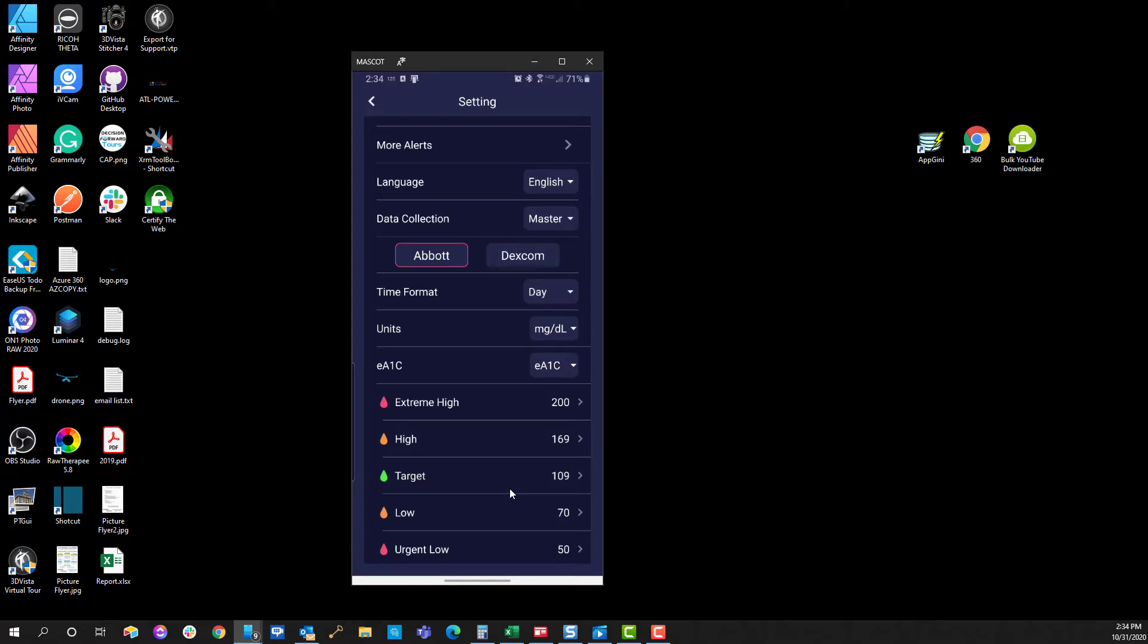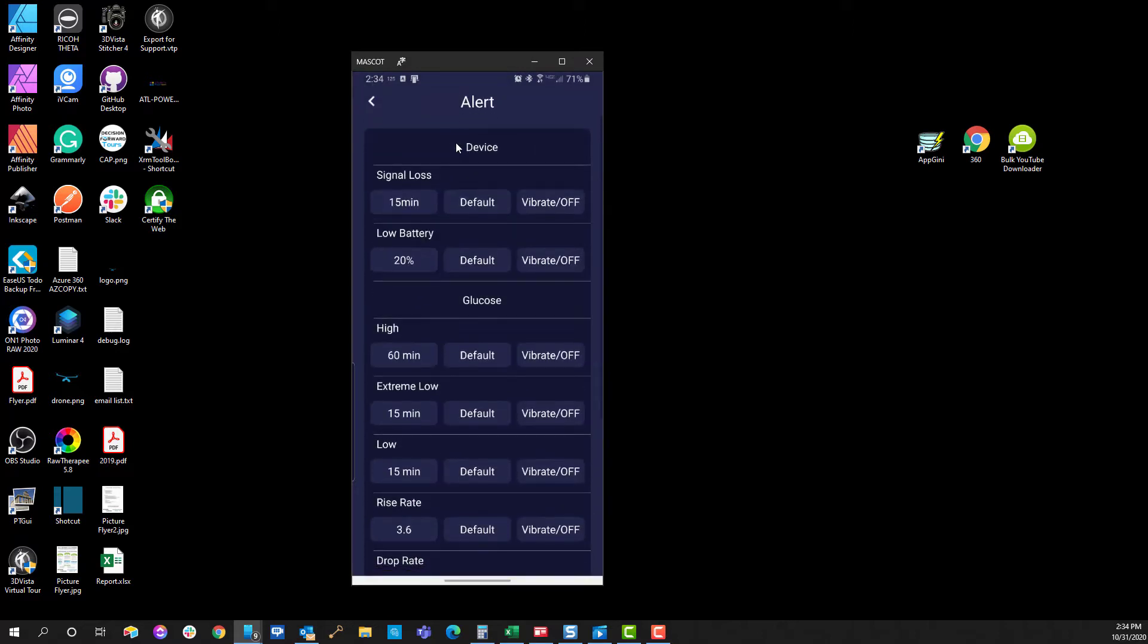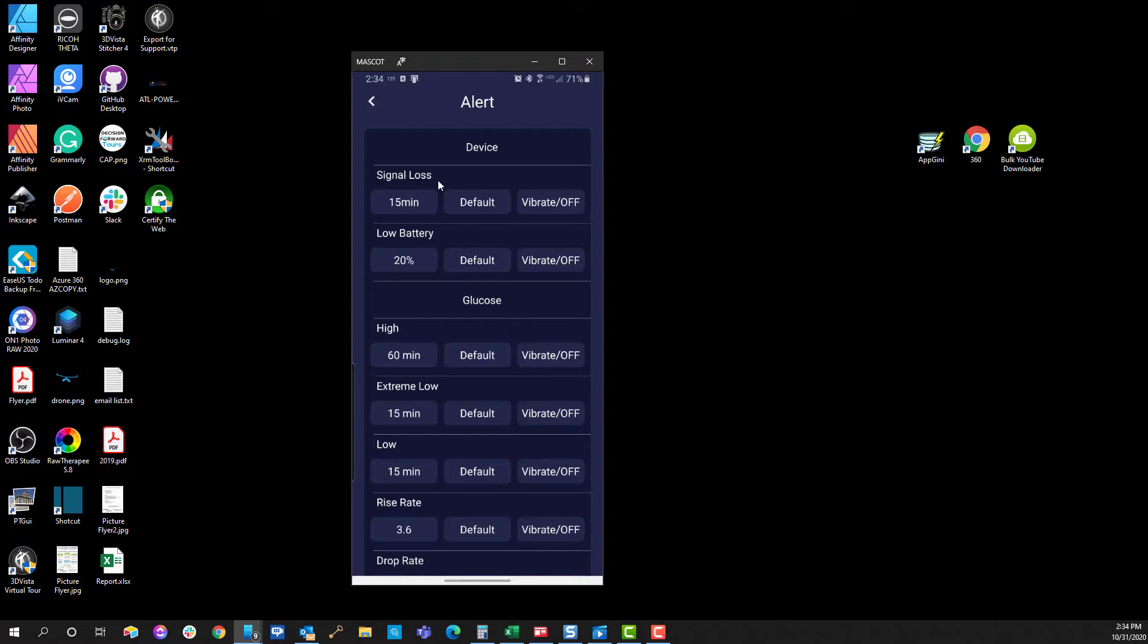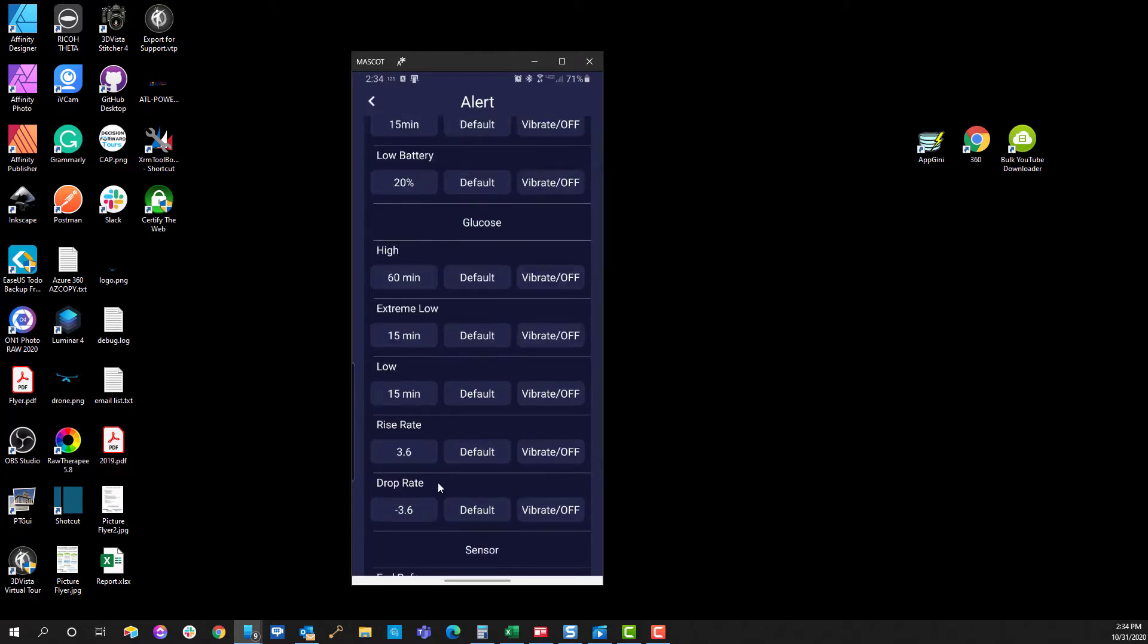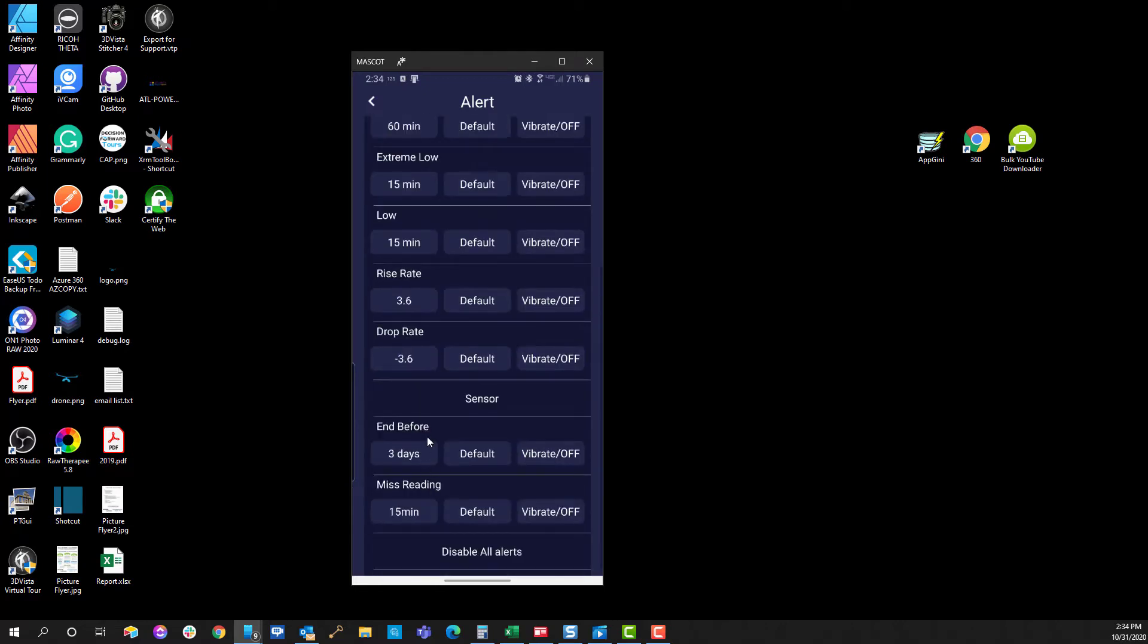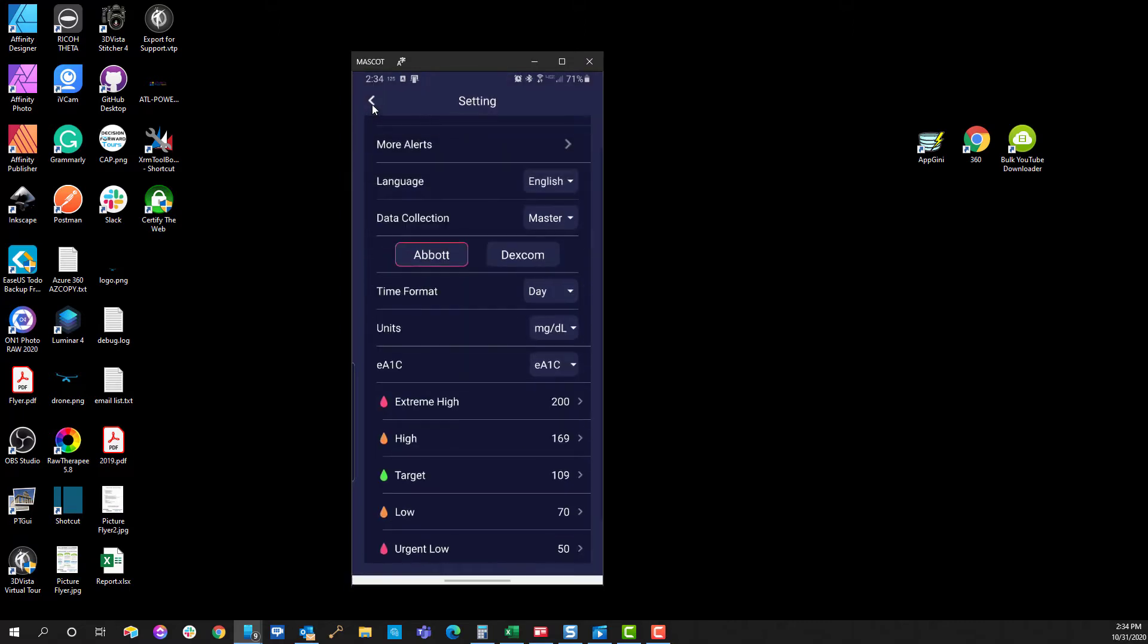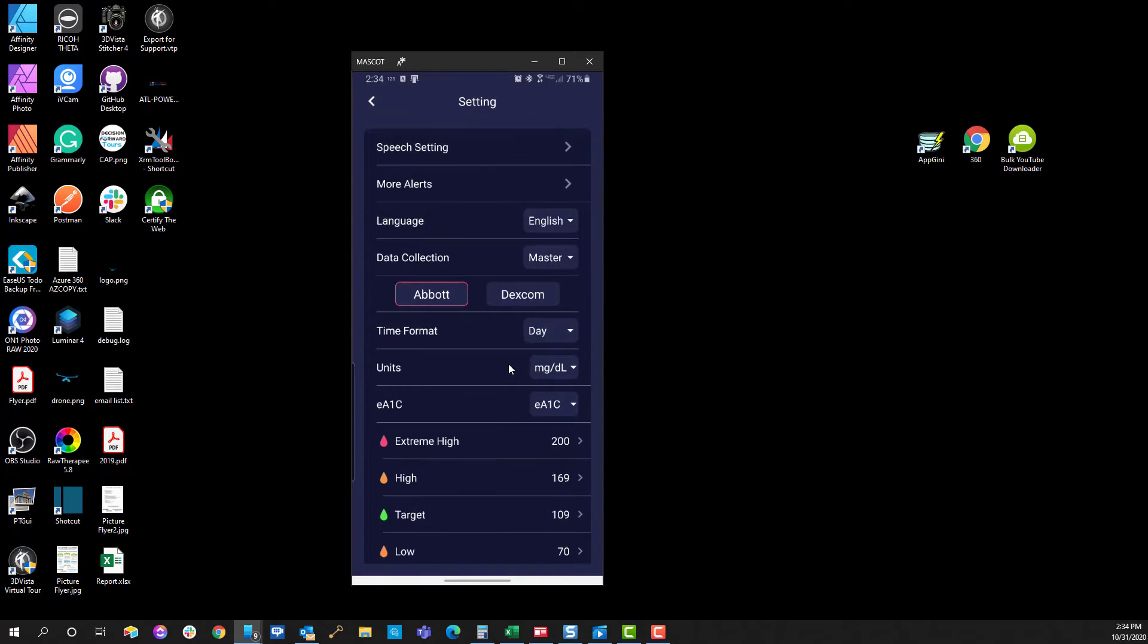You come up here to alerts or more alerts. Everything is on by default, but you can turn things off or make adjustments by clicking into any one of the settings. Notice that you will get alerts about the device if you have a signal loss or low battery. Under the glucose area it will let you know if you're high, if you're low, if you're extremely high, extremely low, what your drop rate may be. You'll also have another area for sensor alarms. It'll let you know three days before the sensor is going to die. If you've missed a reading greater than 15 minutes, it will also let you know—that's an indicator that maybe the software's become disconnected from your bubble device.